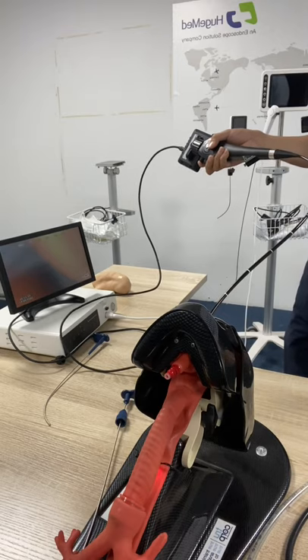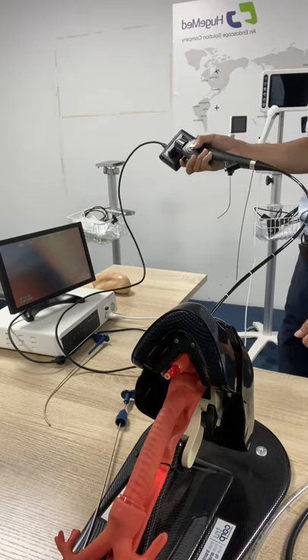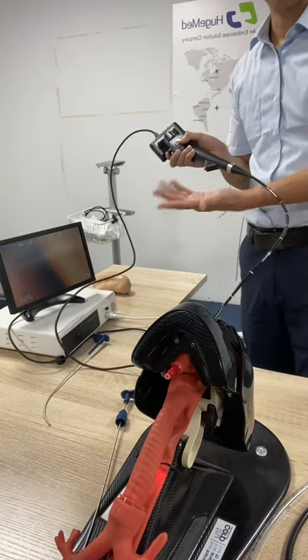When you have finished the operation, just press this button again. The indicator disappearing means that the recording has finished.